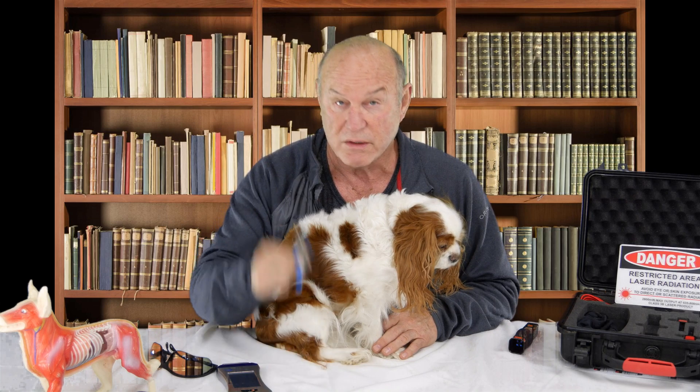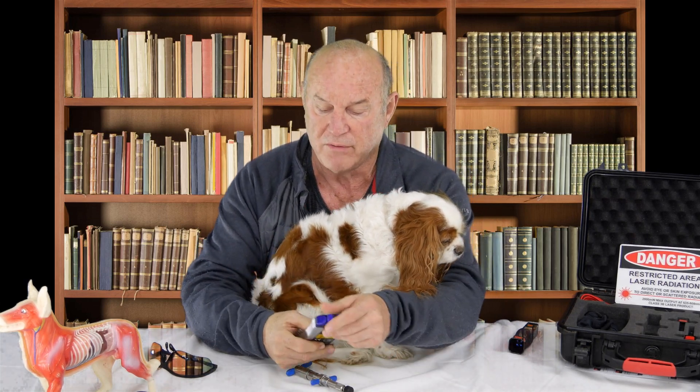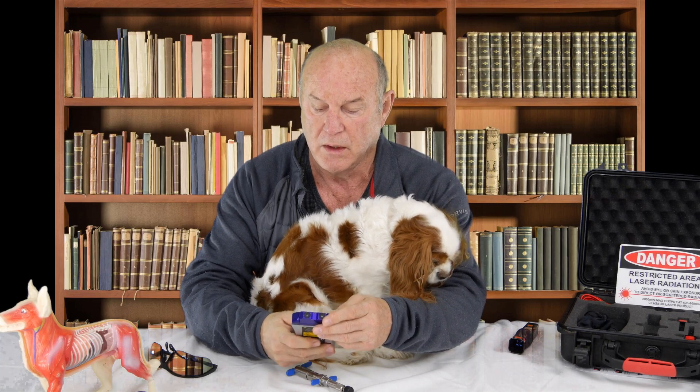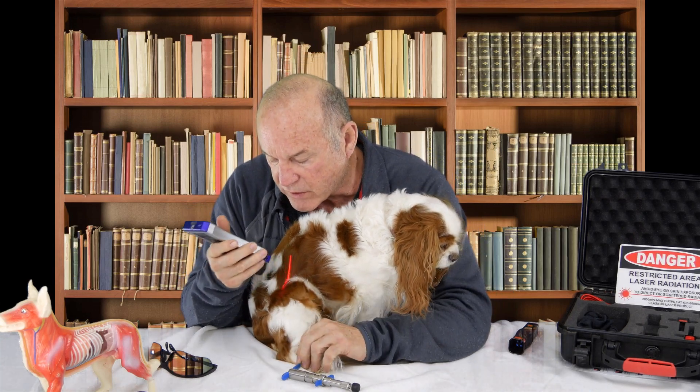When we use this device, we have about a 70% chance of resolving the problem without surgery. When we use this device combined with a frequency-specific laser — some of you have this device — we laser these animals around the knee in this approach, and the success rate for that combination rose to about 95%, 90% for sure.